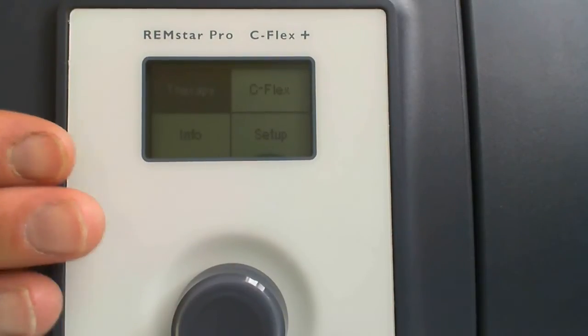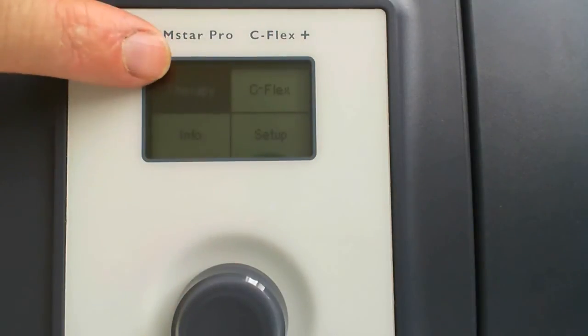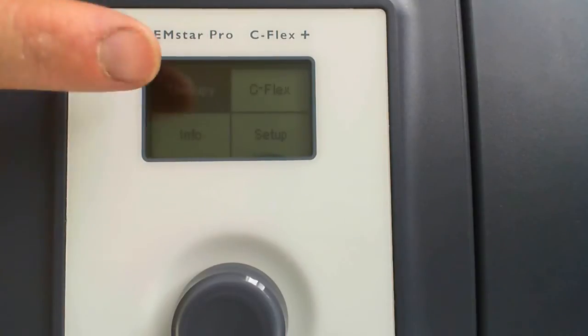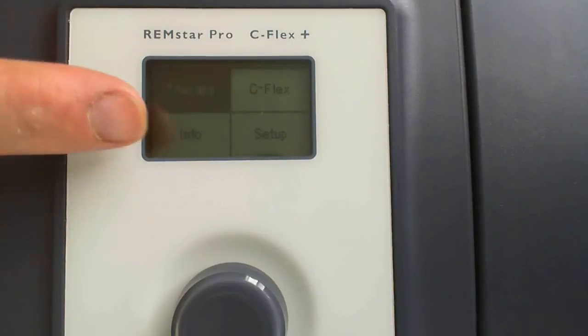But you do need to know what is in the Clinicians Menu, because a lot of the choices that you're going to have here in your Patients Menu are based on those. And I'm going to go through and show you what the different settings are that are going to affect this.